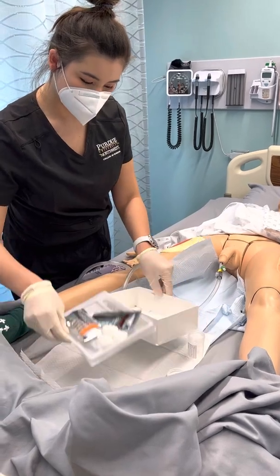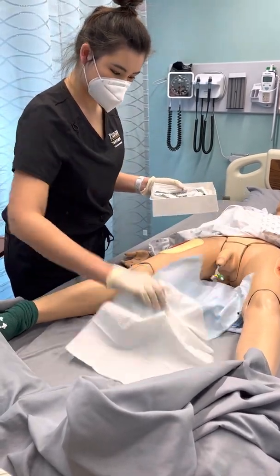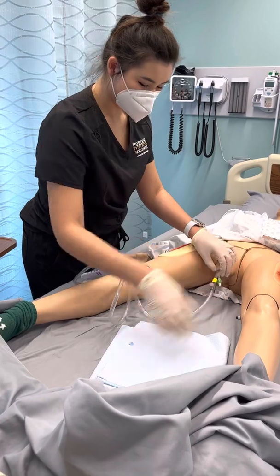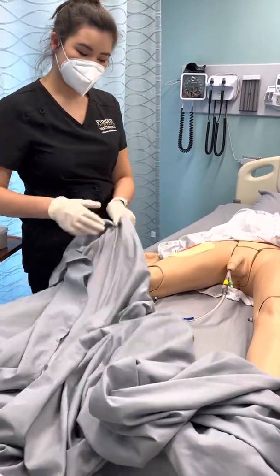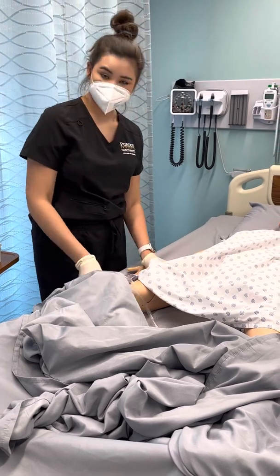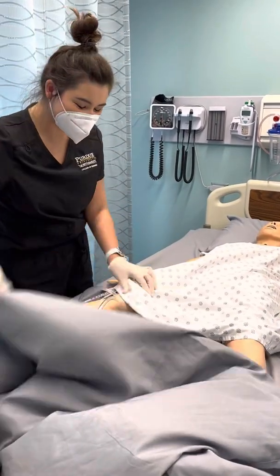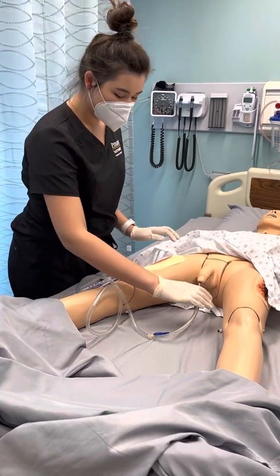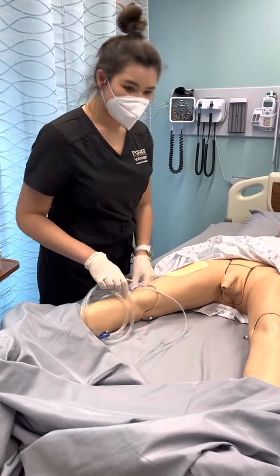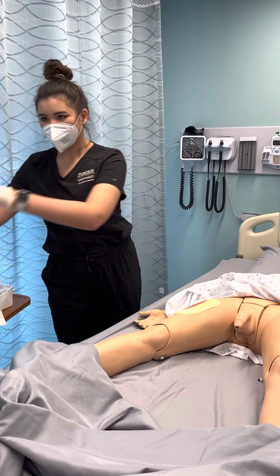Now I'm going to clean them up and remove all the trays and stuff. Then I would set them back up. I would leave the chuck there if I was going to take the catheter out and place another chuck. I would tell them there might be some discomfort, not pain, and tell them to take a deep breath, and then I'm going to pull it out. Then I'd take this away, clean up, leave the bed, and wash my hands before taking it out again too.